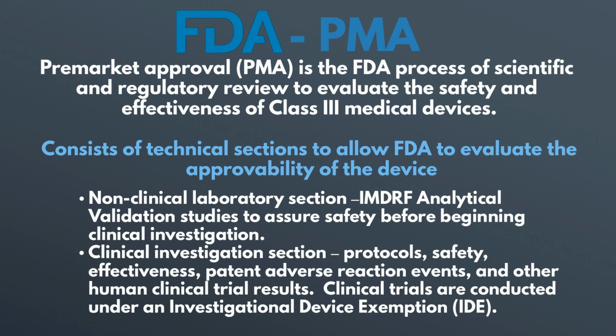It may require that you do non-clinical studies. And some of this may be the IMDRF analytical validation studies that were listed as part of the IMDRF, and it also will involve clinical studies that need to be done. Again, these protocols can be described through the IMDRF process.